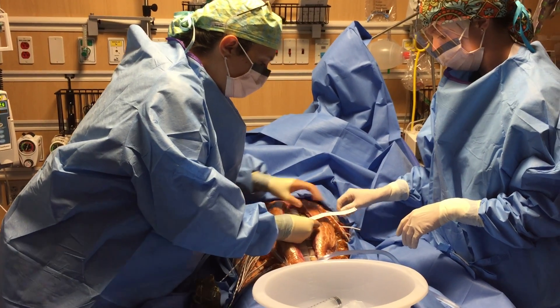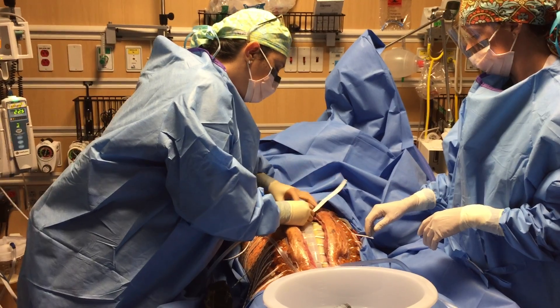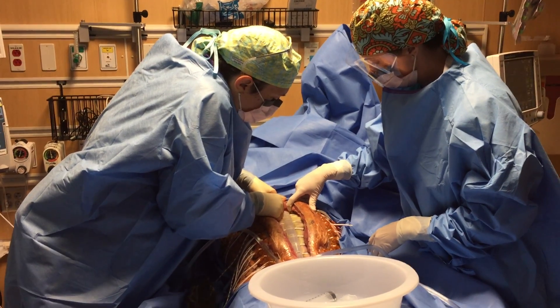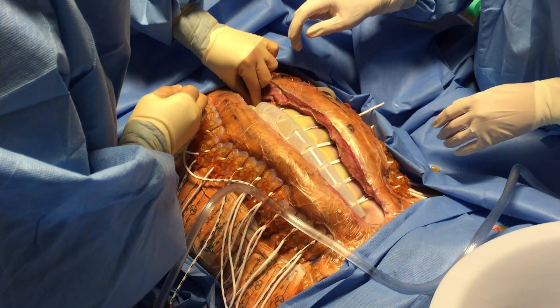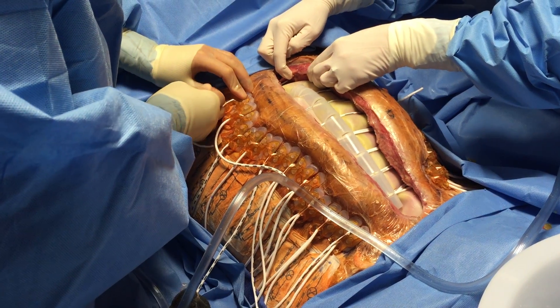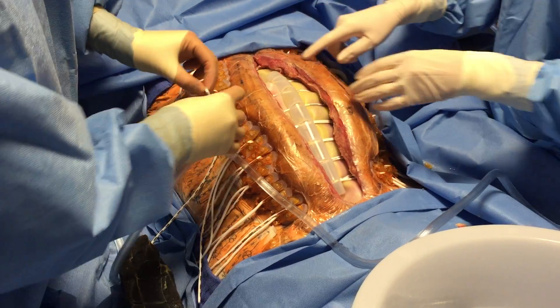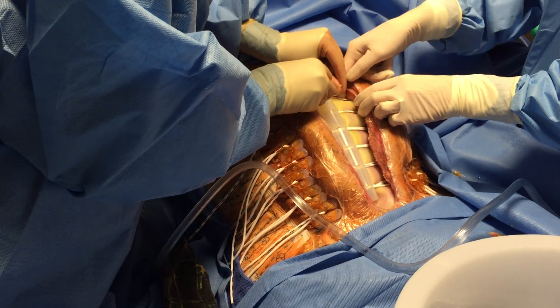At this stage I'm going to double-check all of our elastomers. We're at six here, three and a half inferiorly, and three and a half superiorly — so we're obviously making progress. I think a couple of these can be adjusted. You're going to pull it up on one side only — the side you're adjusting. Gently pull it from one side, advance it 90 degrees as it comes out of the skin, then slide it right back into that button. Double-check that your tension is appropriate — you want to confirm it is two times the length of a non-tensioned hash mark. Same thing here; I think we could probably adjust that one too.